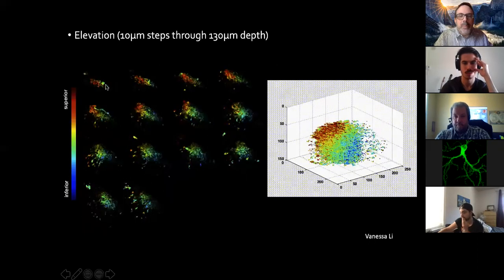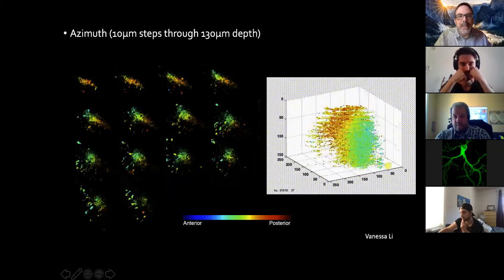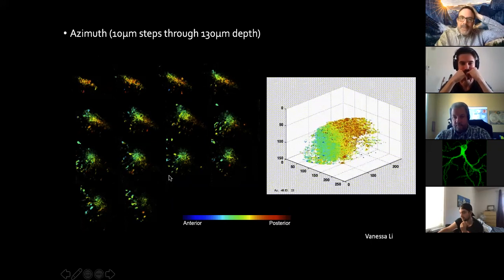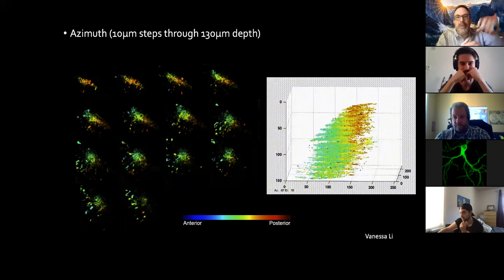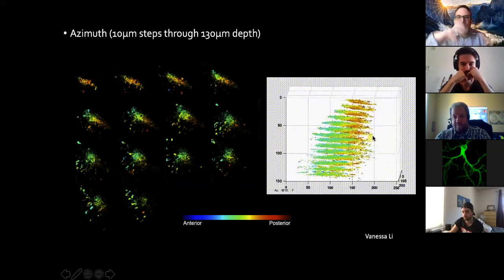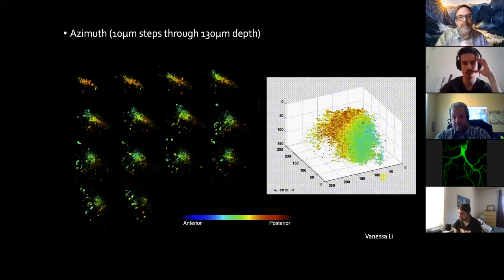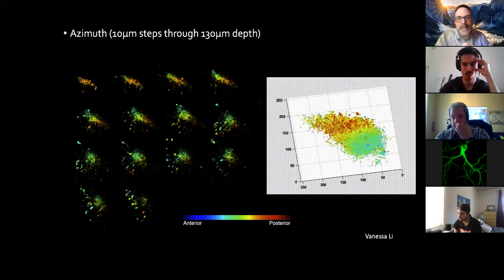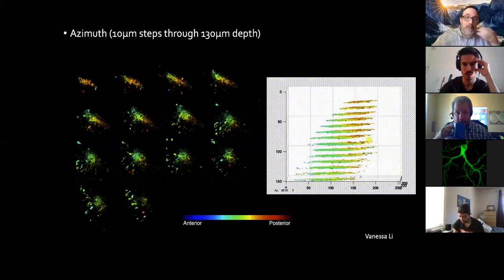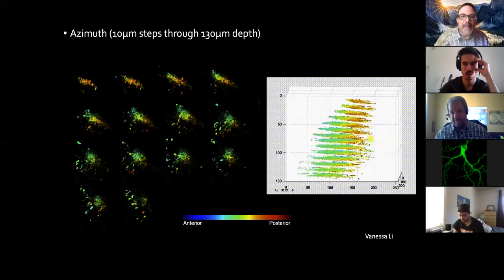So what I showed you before was a single optical section, but if we do optical sections through the entire tectum rapidly while presenting these stimuli, we can generate not just a single optical section map, but the map in 3D throughout the entire neuropil of the tectum. And that gives a lot more information. I think this is one of the first times that a three-dimensional topographic map has been studied from the initial development of that projection. In fact, we're able to follow these maps in these animals from almost the day the axons arrive in the optic tectum until much, much later when a complex map has formed. So there's a lot of power now for understanding the formation of maps.